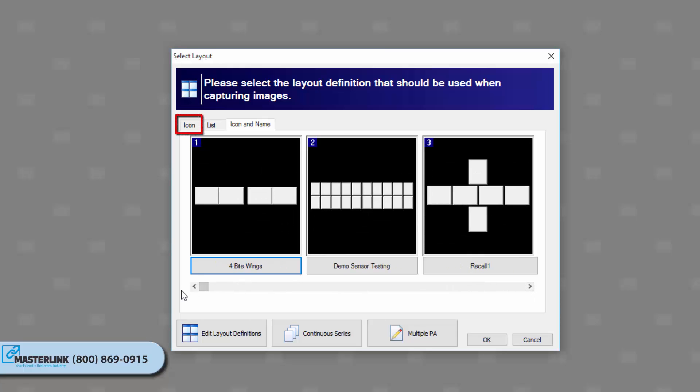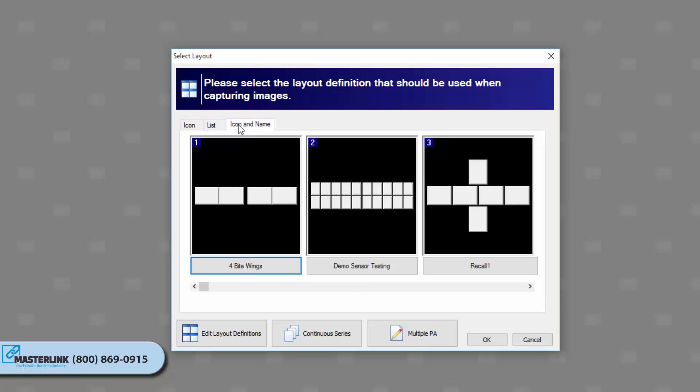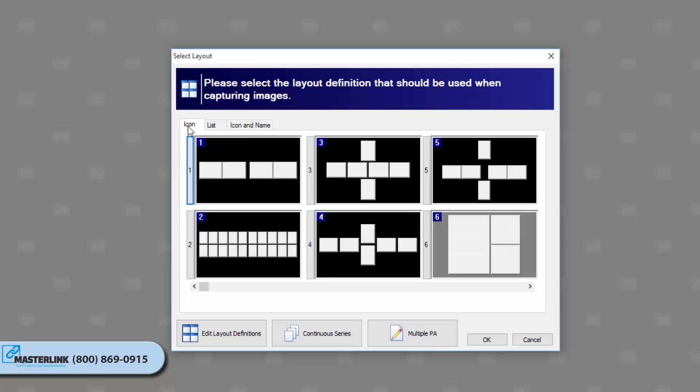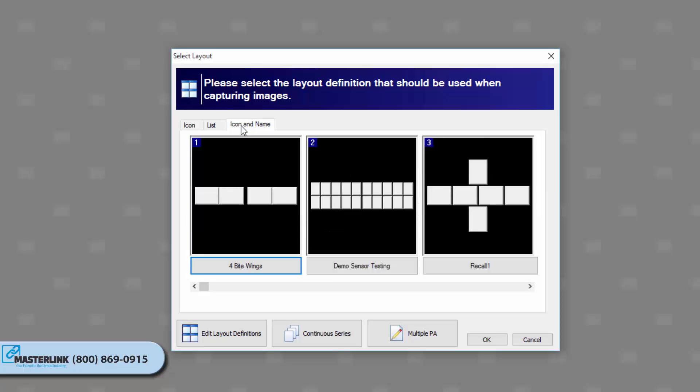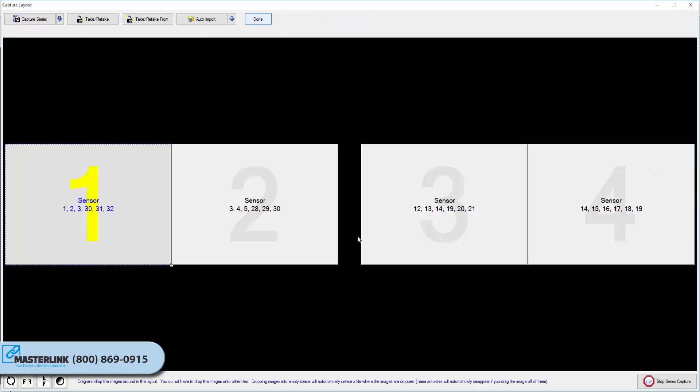Note: by default, this window displays available layouts in icon view. Additional views include list and icon and name. Select the tab preferred for viewing layouts on the selection screen, and it will be stored as a default setting for the workstation. Select the desired Capture Layout by double-clicking on it, or click on it once to highlight it, and then click on OK.